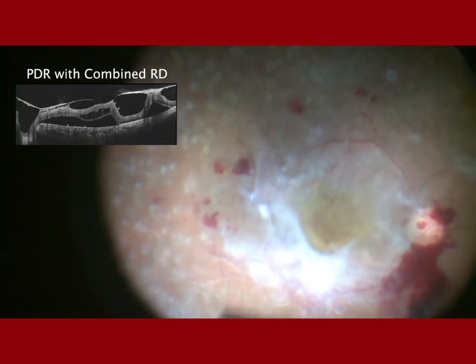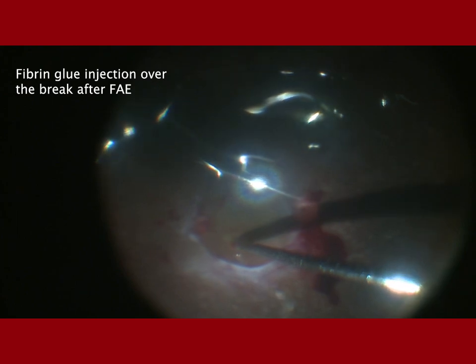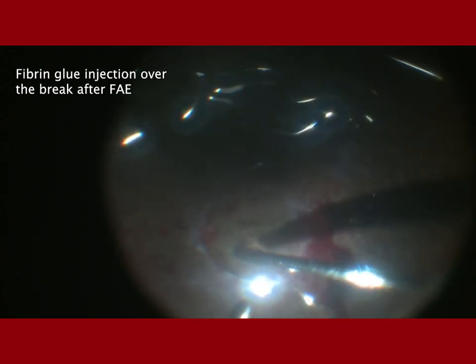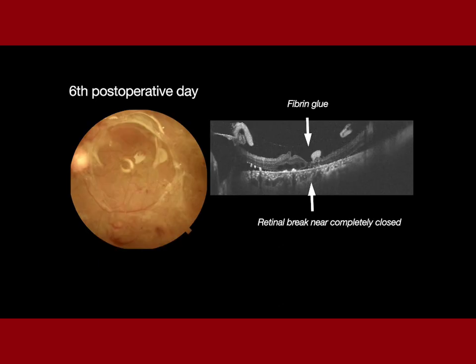This was another patient with PDR combined RD where the causative break was very close to the macular center. After mild laser, fibrin glue was injected over this break and silicone oil was administered. On the first post-op day, the break was covered with glue, and by the sixth post-operative day, the hole was closed, the retina was attached, and the glue was no longer seen.